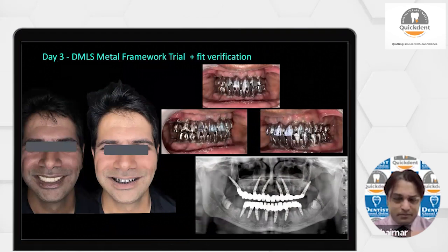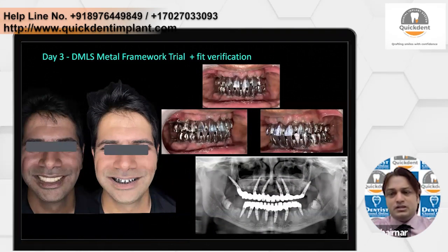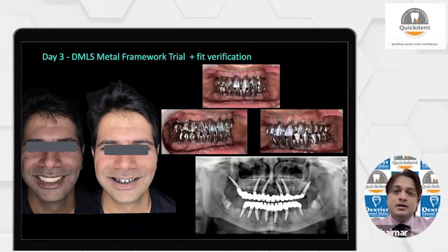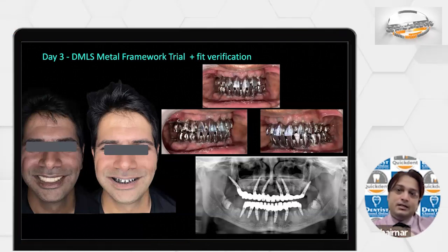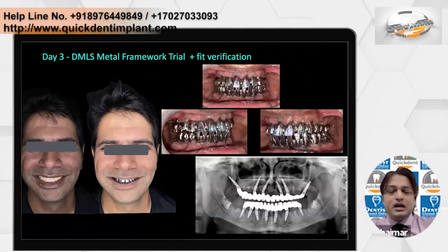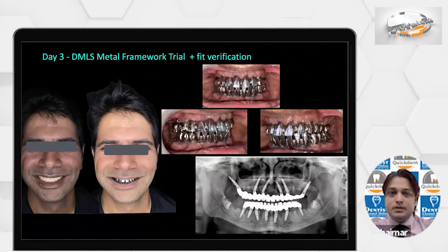Actually for me it was perfect, but according to the patient he wanted slightly narrower teeth, and he stressed on that, so we did that. After this, we did the modification. According to that modification, metal trials were printed. We also did the metal framework trial.